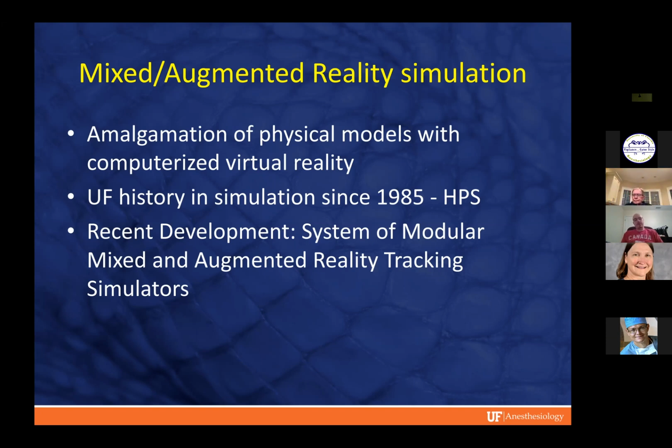And there may also be virtual soft tissue. And the computer's hardware and software is capable of tracking where things like that ultrasound probe, or perhaps a needle, or the camera view, the position that you would be using to look into this simulation, are. Where are all these things in the 3D world, and how do they interact with each other, and how can you make this physical needle or this physical ultrasound probe interact with virtual soft tissue?